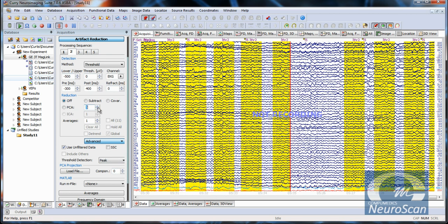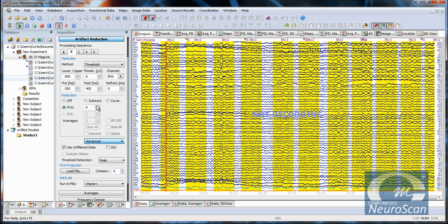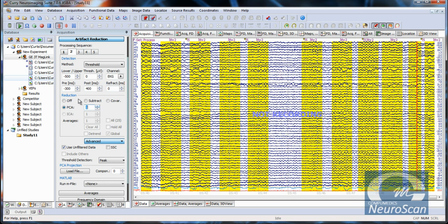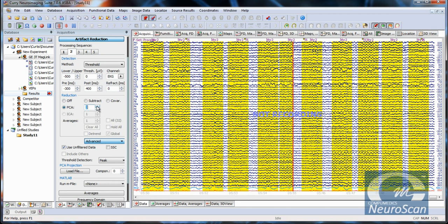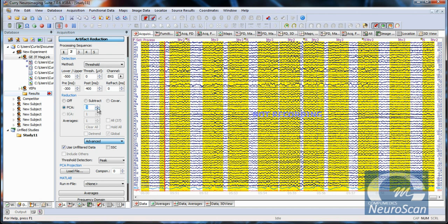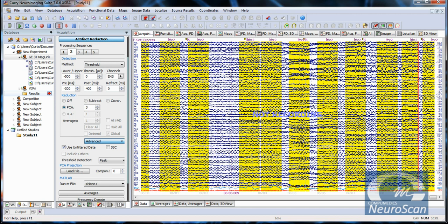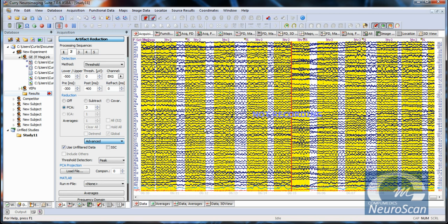The approach that we're going to apply in this particular case is a PCA method. So we'll turn the algorithm on, initiate it, and I'm going to switch it off for one moment. We'll switch it back on, and we can advance up here, and we are now getting a very, very clean and clear suppression of the ballistocardiogram artifact. I'm using 3 components, and here we've just switched from a situation where we've gone from eyes open into an eyes closed state where we can see very, very clear alpha.